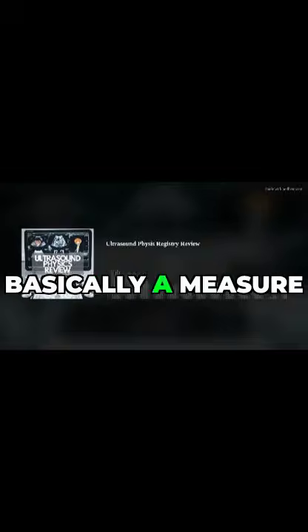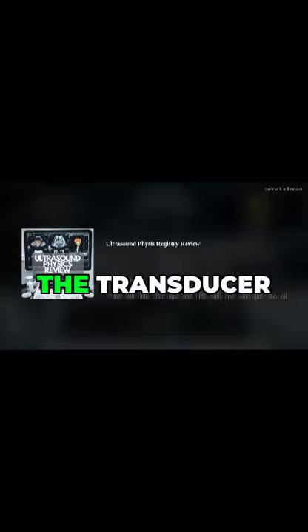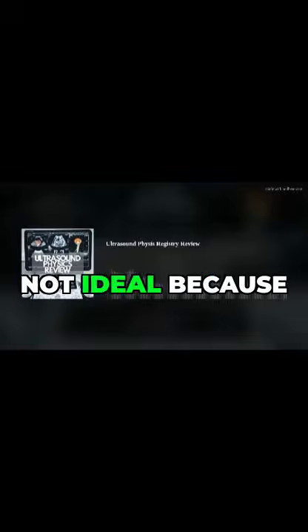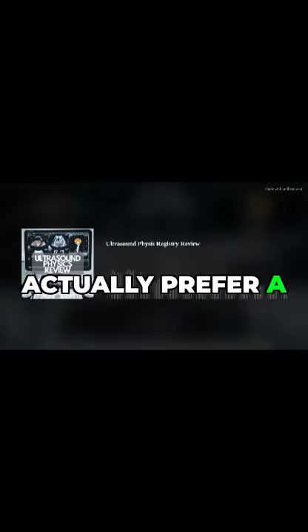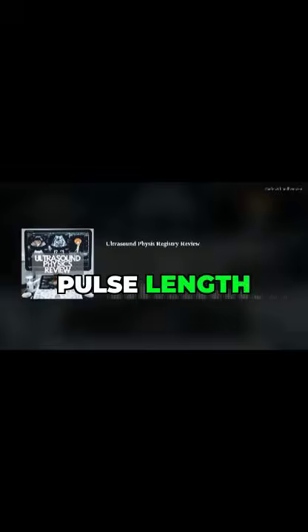Q factor is basically a measure of how pure the frequency is. So a high Q factor means the transducer is producing a very narrow range of frequencies, which is actually not ideal because it results in a longer pulse length. Okay, so a high Q factor means a narrow bandwidth. Right. Long pulse, bad for axial resolution. Got it. We actually prefer a low Q factor, which means a wider bandwidth, shorter pulse length, leading to better axial resolution. Okay, so lower is better when it comes to Q factor.